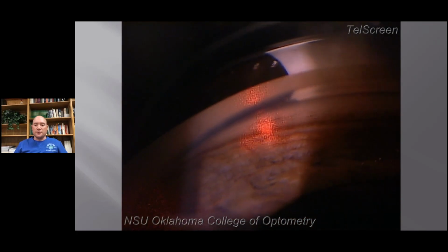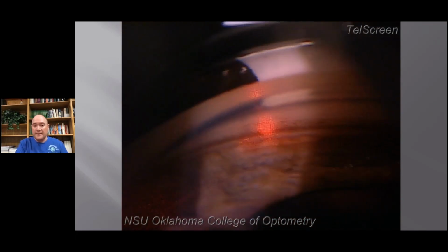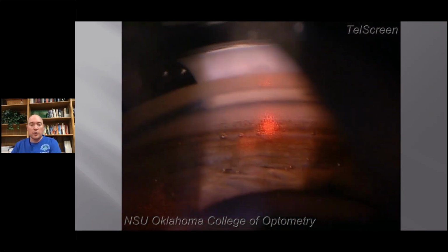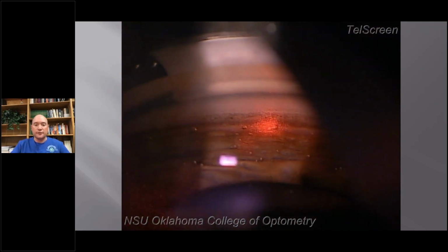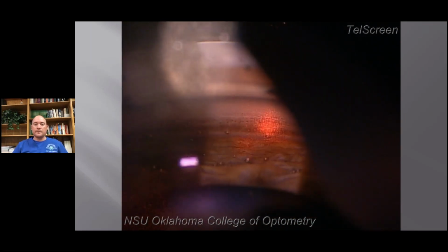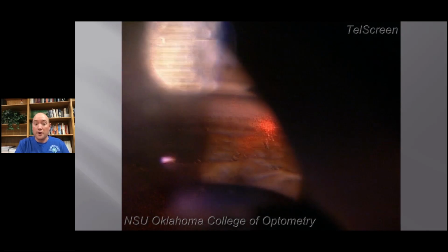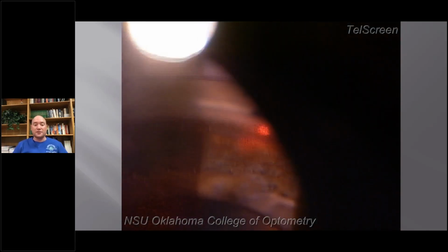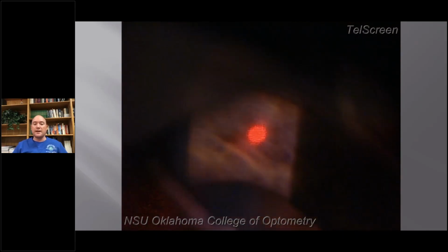And we're ready to go and basically do this mirror. And we'll do 8 to 12 shots in this mirror. And then when we get to the other edge of the mirror, we will rotate. Nice crystal clear focus on the trabecular meshwork here. And again, we've just finished 1 quadrant. We started at 9 o'clock. We're up near 12 o'clock. You should be about 25 shots in. There's a mirror rotation.